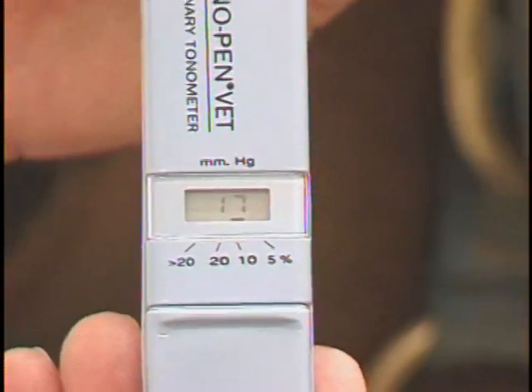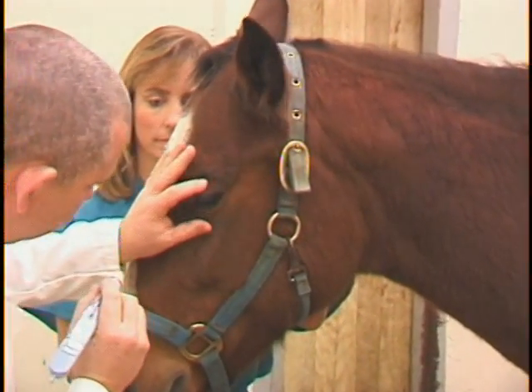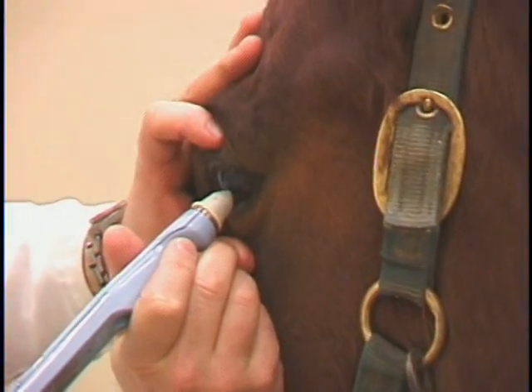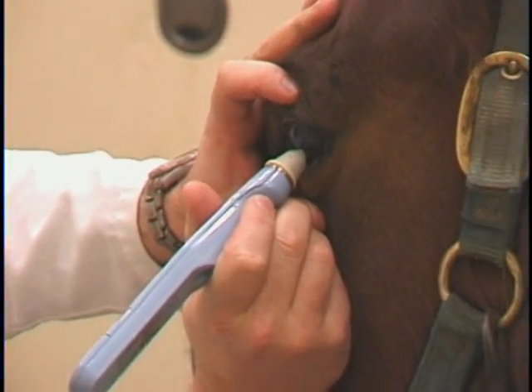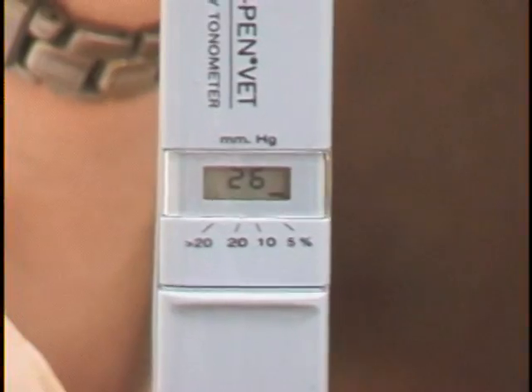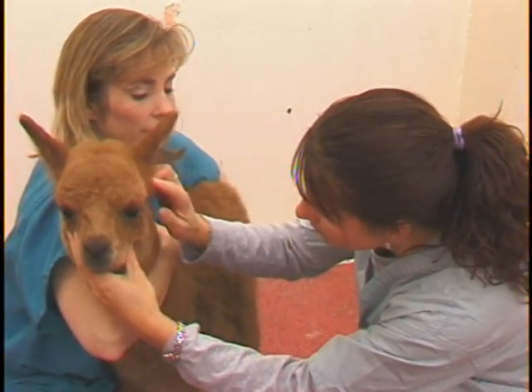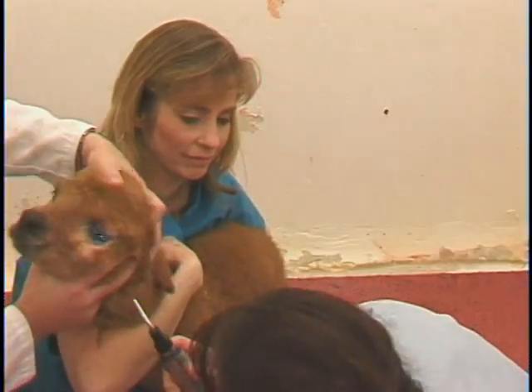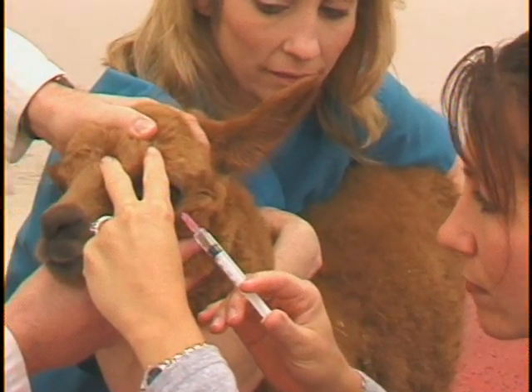If no readings are taken, or the examiner takes too long to obtain accurate readings, the Tono-Pen will automatically shut off to conserve battery power. Push the activation button to turn it on again. When the clinician or technician has finished with the Tono-Pen, it should be placed in the protective case. The Tono-Pen can be used in a variety of species, including dogs, cats, pocket pets, horses, cattle, camelids, and many others.